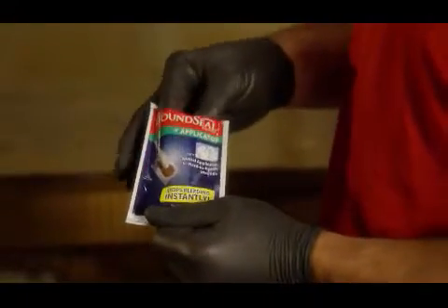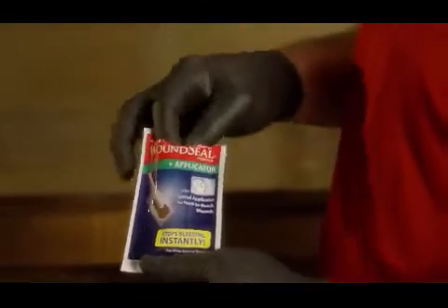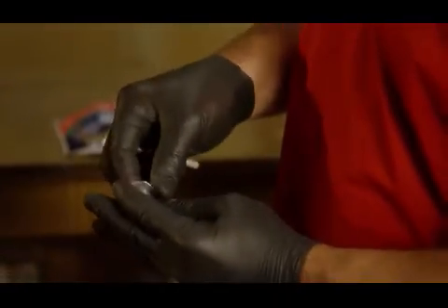This is wound seal powder with an applicator. Simply open the package. It's a hydrophilic polymer with potassium ferrate. It stops bleeding and disinfects the wound.